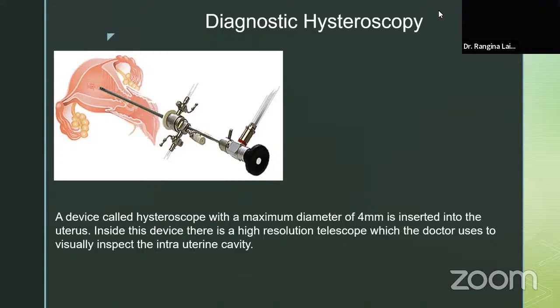They don't know how to put in an inlet, and when we ask whether your hysteroscope nipple is working or not, whether the water is passing. It is very important to know the instrument we are using, because from that only we can give the result. If we don't know the instrument itself, then we won't be able to do a good procedure.